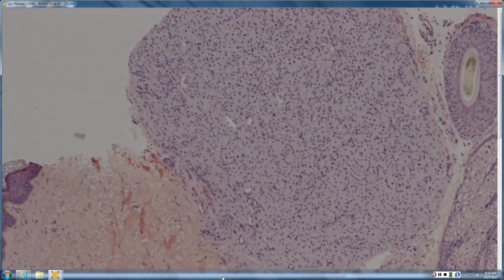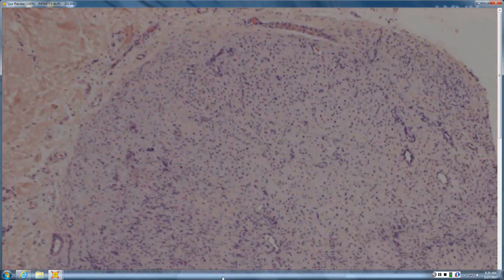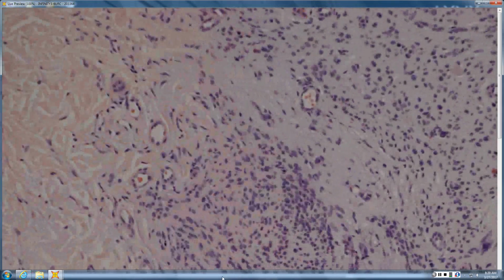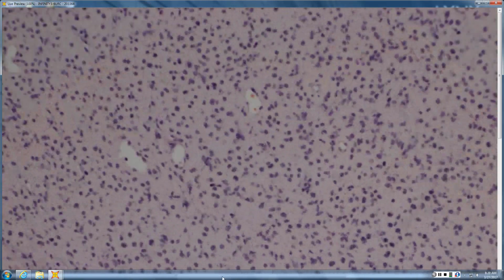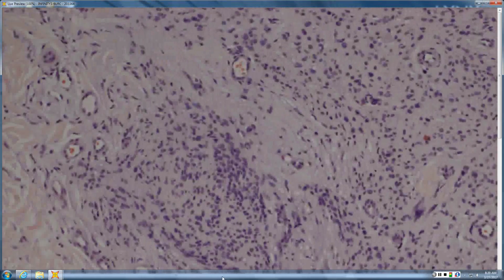So this is kind of vertically oriented and epithelioid. The vertical orientation is some hint that it may be nerve. When it's epithelioid like that, you could think of neurothekeoma. You could think of one that's not neural. You could think of an epithelioid histiocytoma. So you're going to look for things like, is it 13A positive? Is it staining fibrohistiocytic? Is it staining neural? If this one is S100 positive, then you'd put it in the neural category.